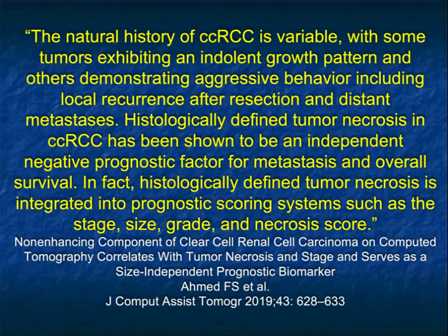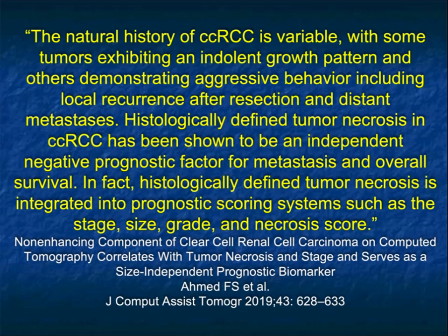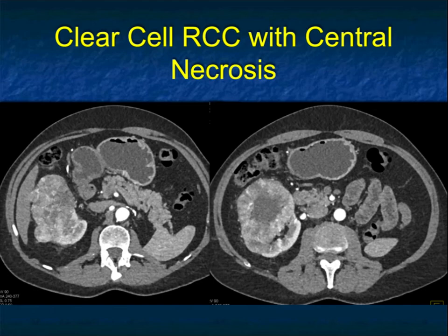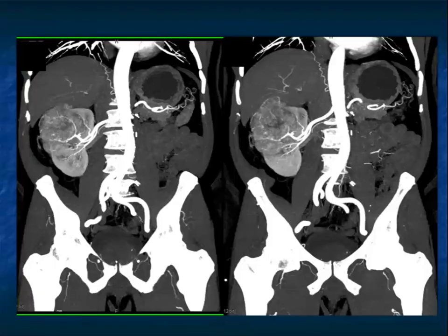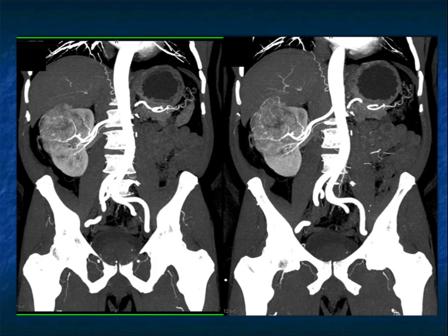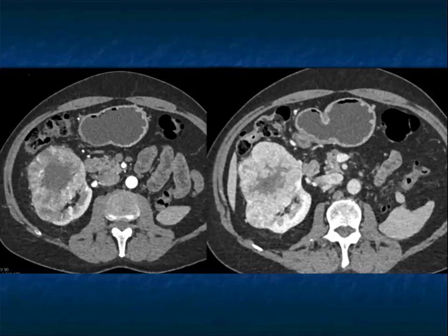An article by Ahmed makes the point that the natural history of clear cell is variable, with some tumors exhibiting indolent growth and others aggressive growth patterns. Histologically defined tumor necrosis has been shown to be an independent negative prognostic factor for metastasis and overall survival. When you have central necrosis, don't measure density in the central necrotic zone — measure in the periphery. Patients with central necrosis are simply going to do worse. You can see the neovascularity, the central necrosis, and the washout of the tumor.